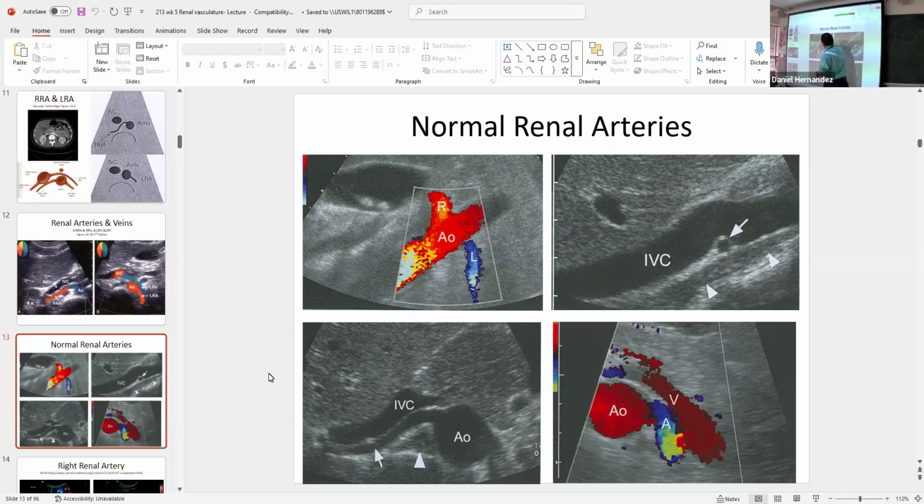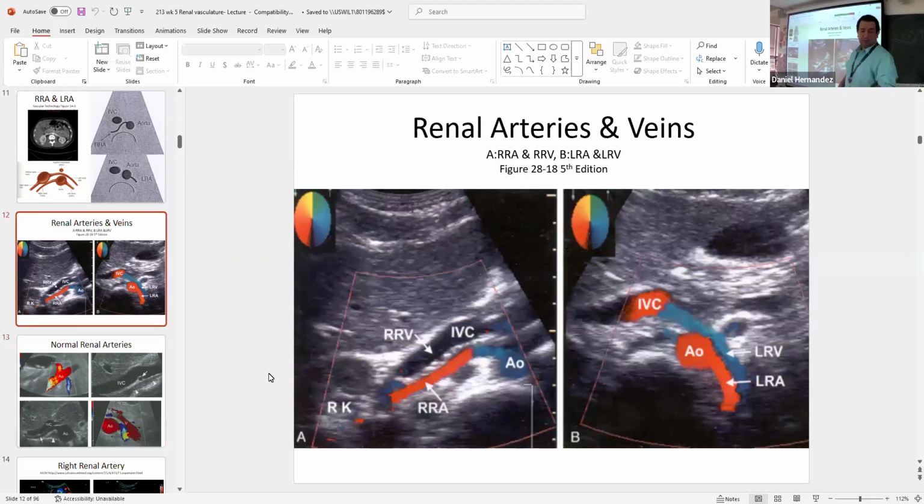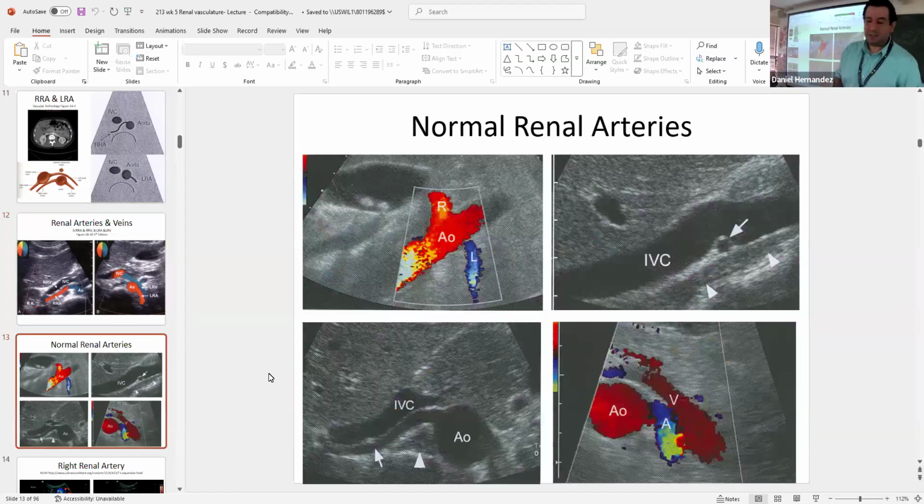And from this approach, you can get pretty good Doppler angles on those vessels as well to get accurate velocity measurements, where sometimes it can be pretty challenging in transverse. That Doppler angle is going to be pretty close to 90 degrees, and it's going to be hard to get a good Doppler angle. Left's a little bit better, but that right one is real challenging coming off there. Versus doing a nice banana peel, you can almost zero angle it, and you're lined up perfect.